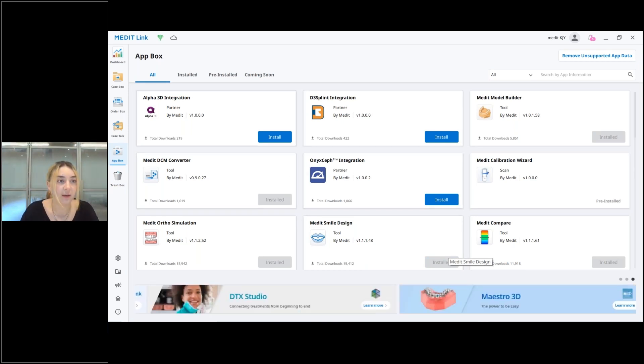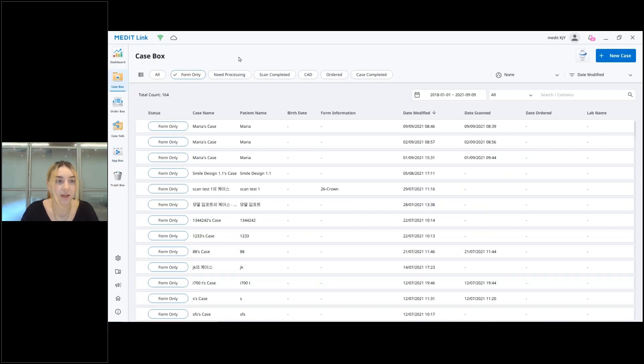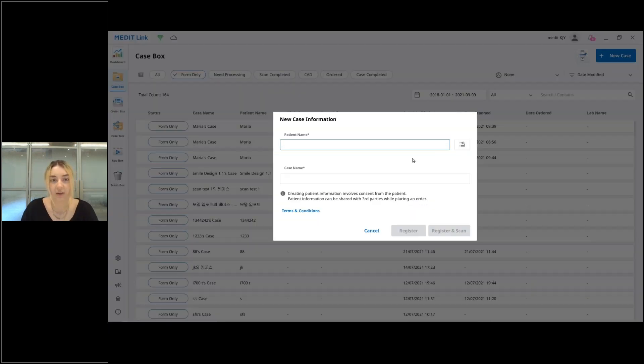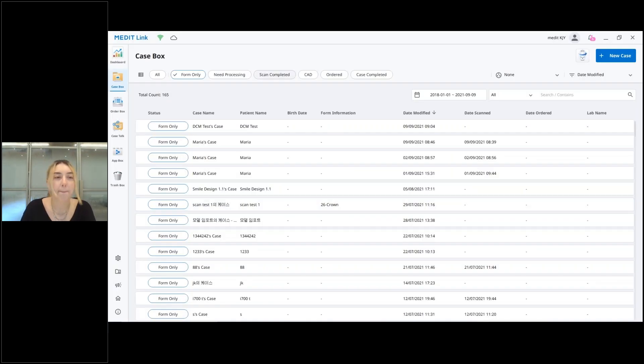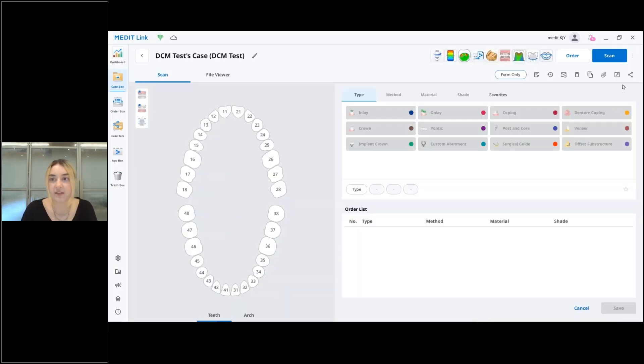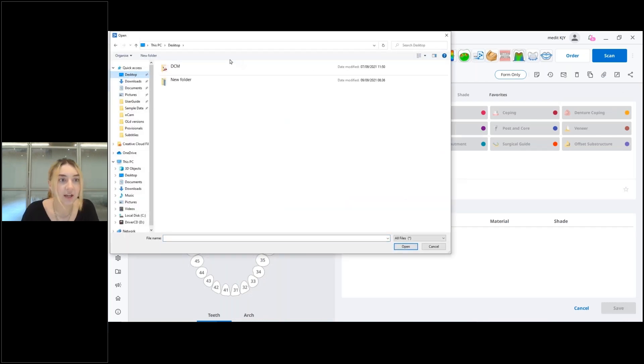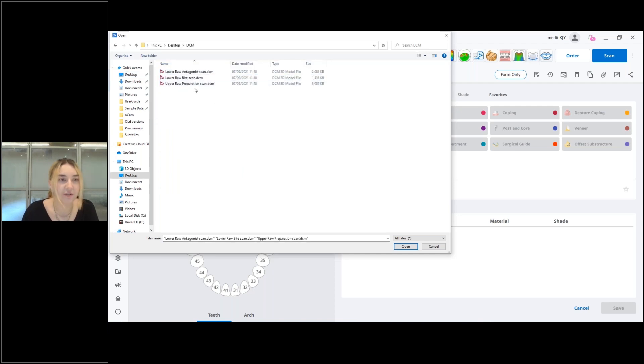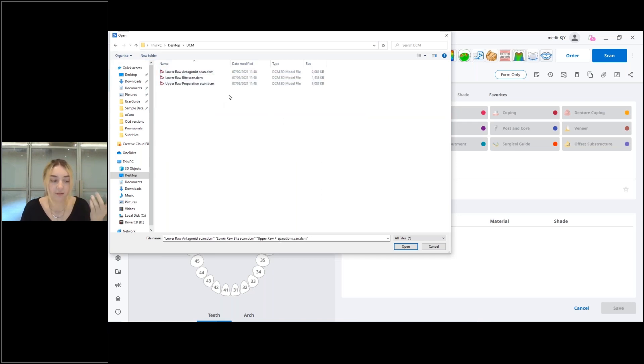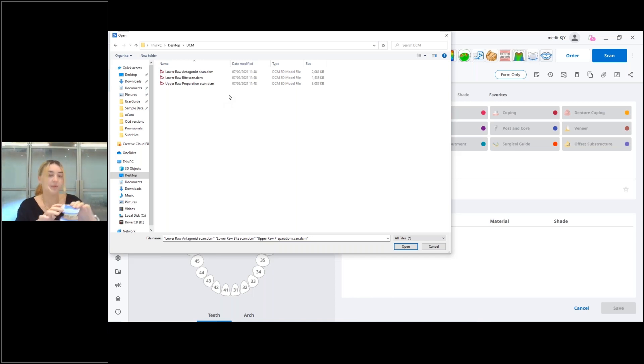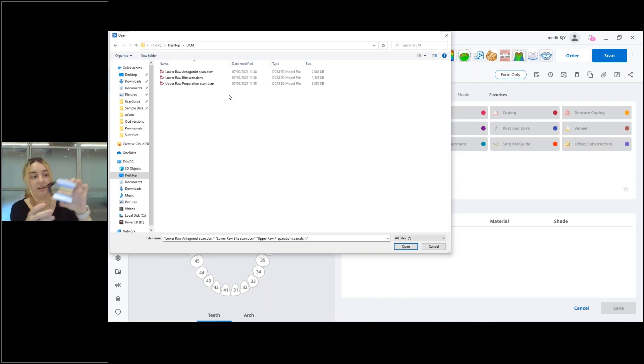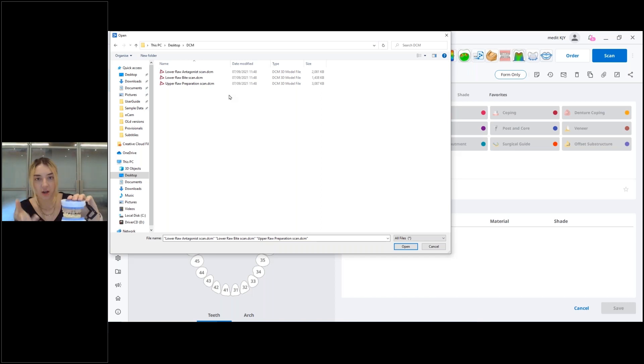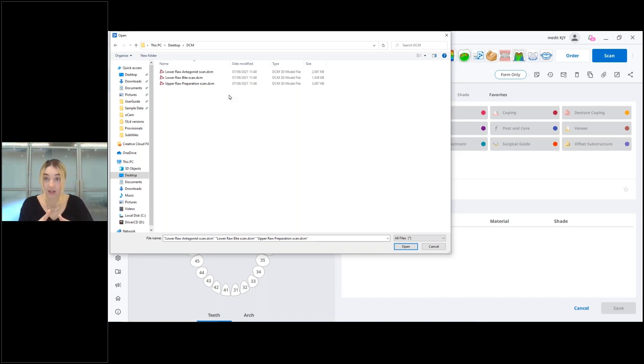You will see it in your case detail window on the top right side. I'm going to my case box, let's create a new case. I'm going to call it DCM test. Here's my case and now I'm going to press this button which is Attach, and here I have my DCM files. You can see that they have 3Shape logo there, DCM.dcm files. We have DCM files of this model, my favorite model probably already recognized.